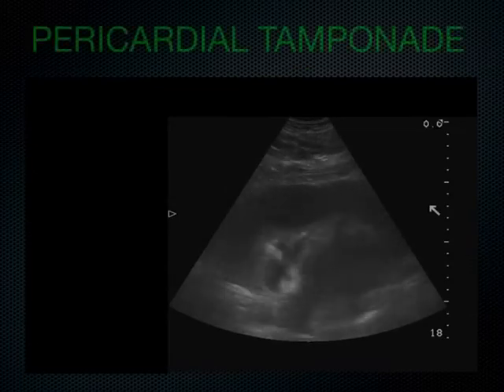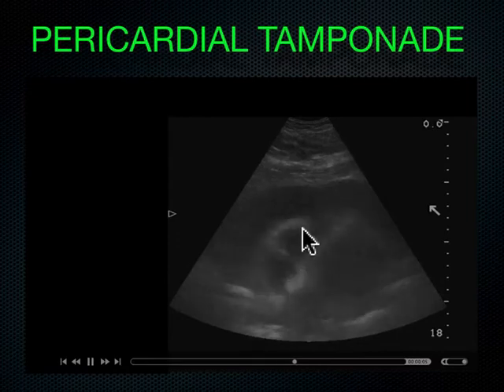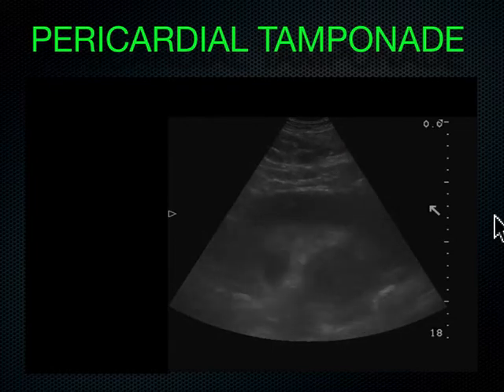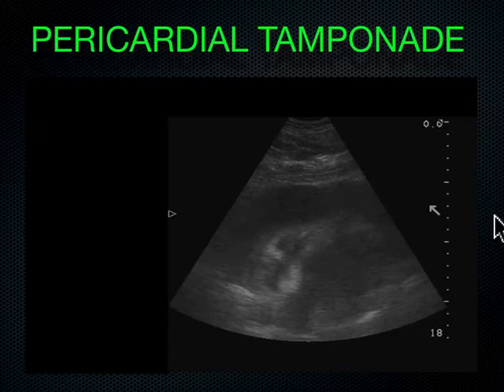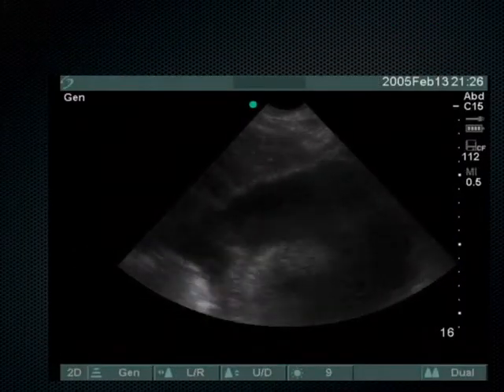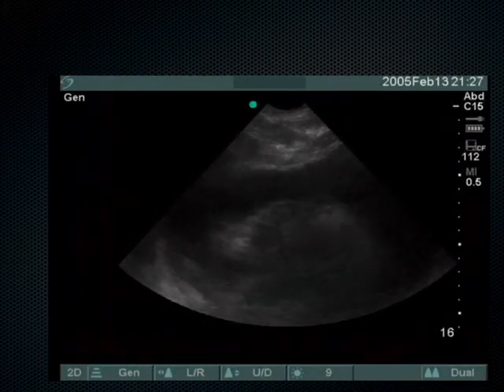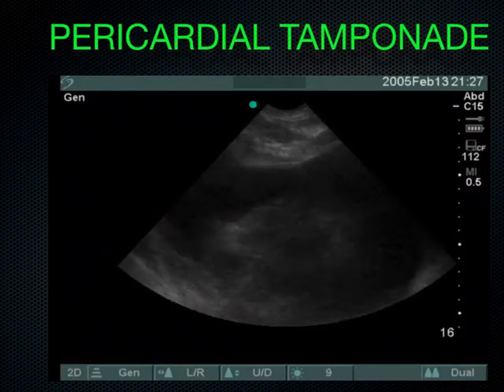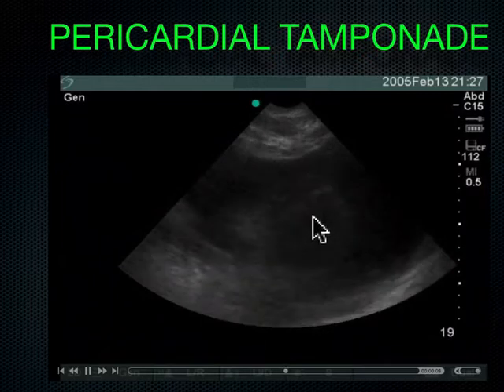This is an example here of the tamponade. Notice again, it's this jumping up and down trampoline effect that's easy to see on the screen to say that there's diastolic collapse. It's just another example here of a pericardial effusion where the heart is swinging around in that pericardium. That's also kind of hard to tell whether there's jumping up and down here or not.